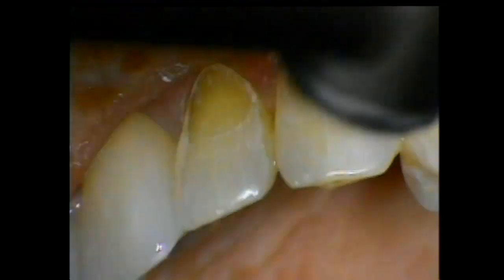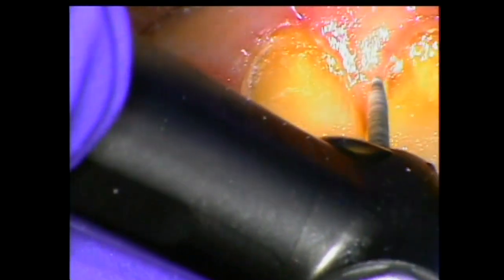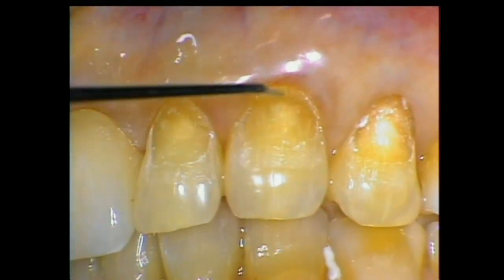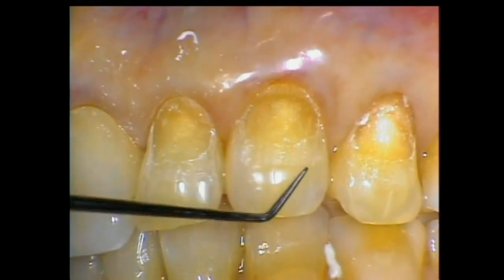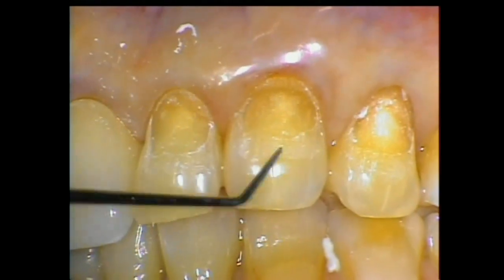Now I want to make sure I've got this all the way into the proximal so that I'm going to hide the proximal margin too. I'm going to add the material to follow the contour of the tooth surface — you're going to follow the convexity all the way up, but you're going to blend the material on the tooth surface past that long bevel.